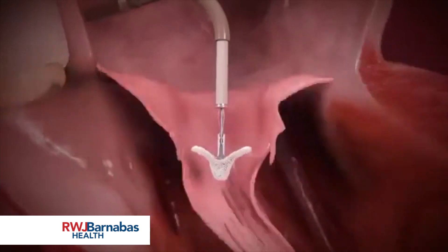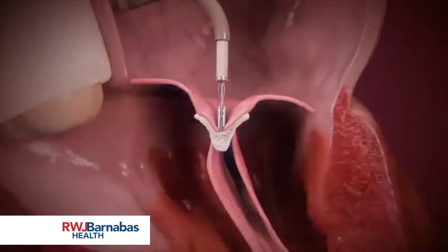Prior to deployment, the MitraClip can be released and repositioned for optimal mitral regurgitation reduction.